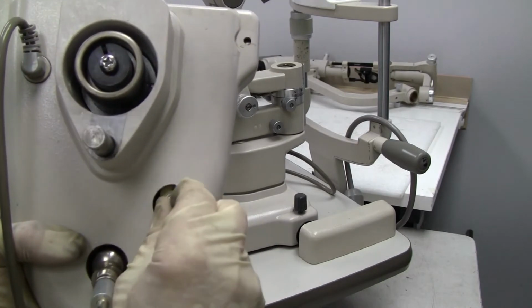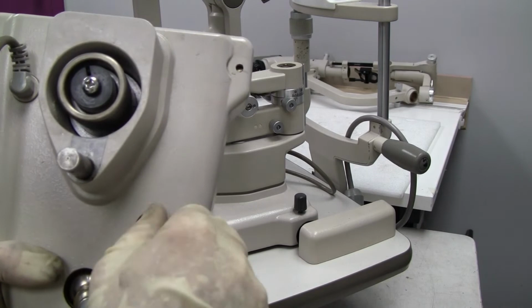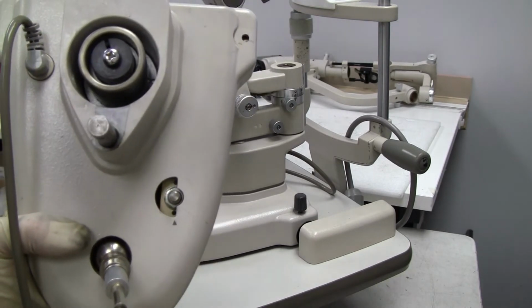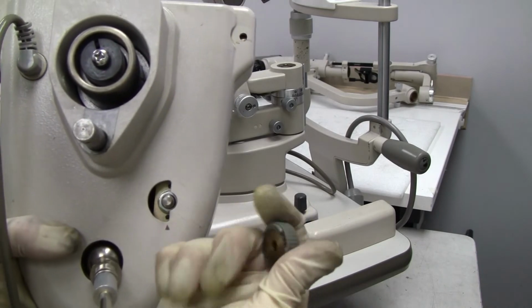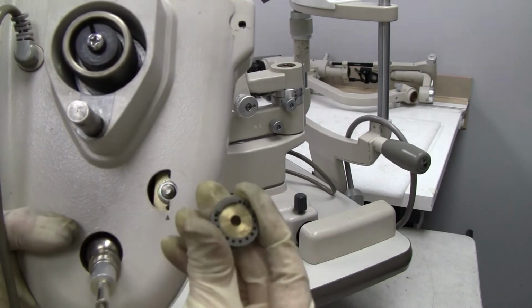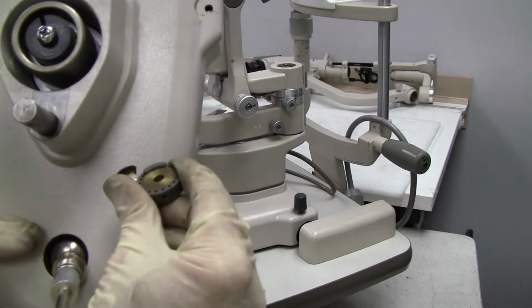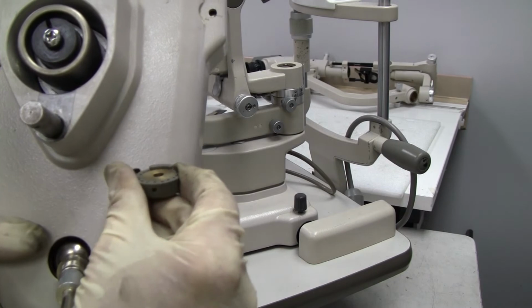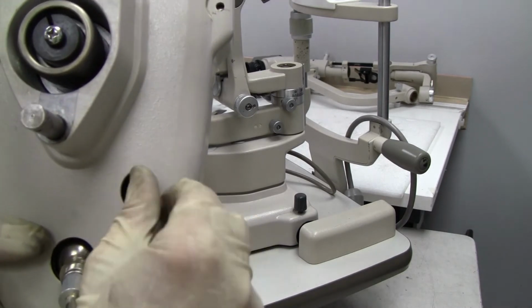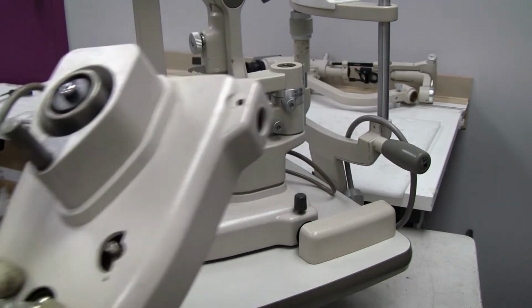So this little rheostat, there's more room to go brighter or dimmer depending on where you set it and where you set your knob. See that little raised part on the bottom of the knob? That fits inside here. So that's just something else that might be important.